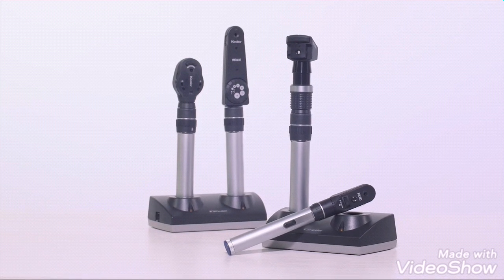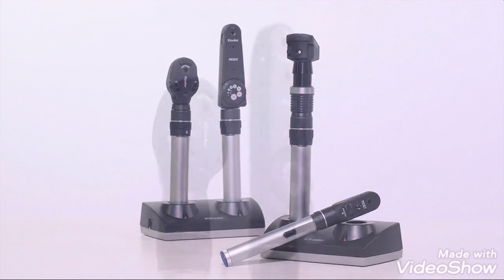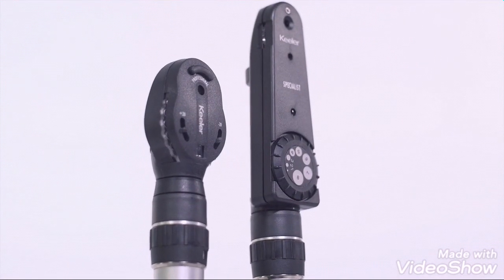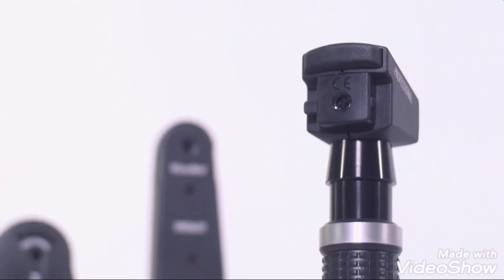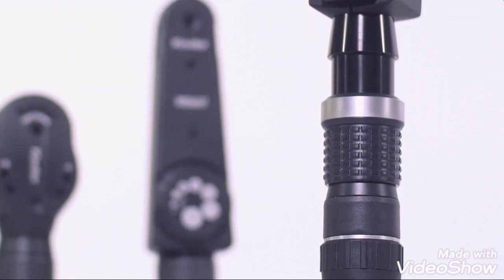Keeler offers a complete line of ergonomic, versatile, and precise handheld diagnostic instruments. This video will provide an overview of the features of Keeler's handheld ophthalmoscopes and retinoscopes and a guide on how to use them.